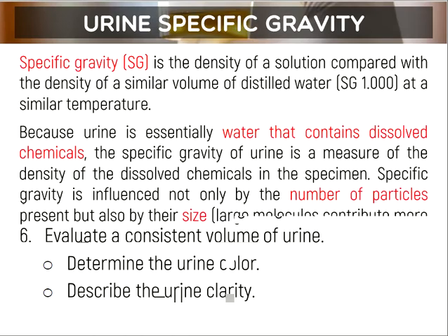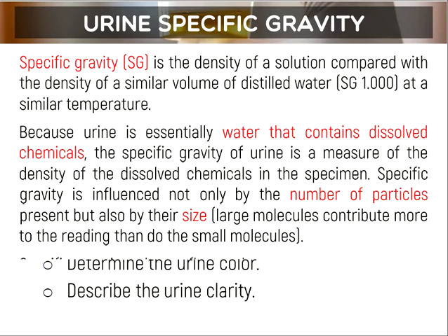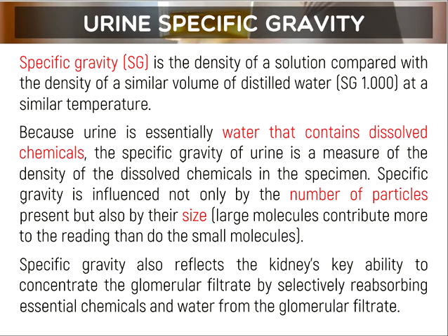Okay? We'll go to the next parameter, specific gravity. Specific gravity is the density of a solution compared with the density of a similar volume of distilled water, so its Sg is 1.00 at a similar temperature.